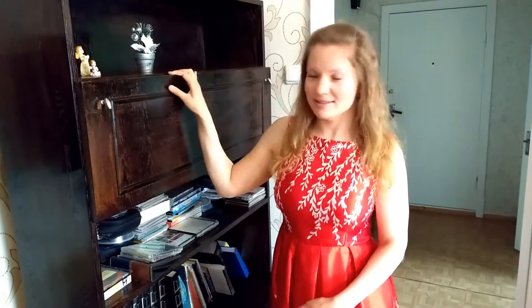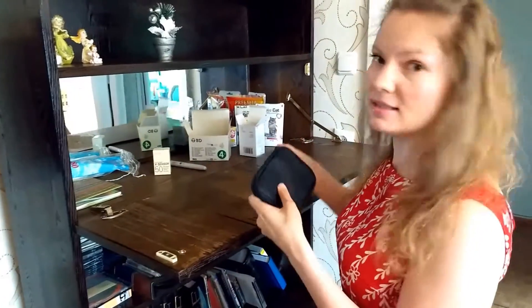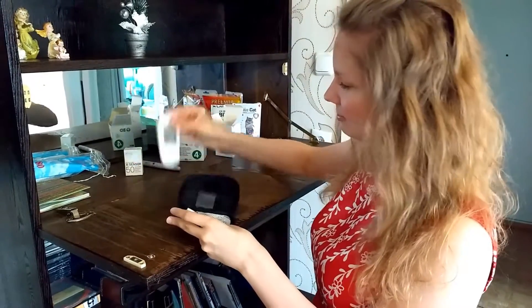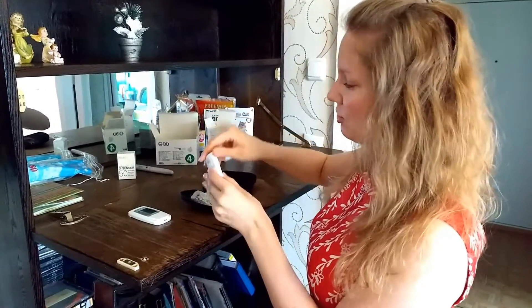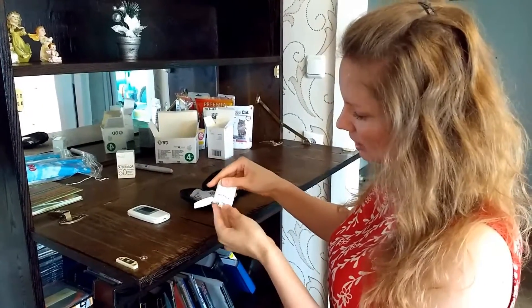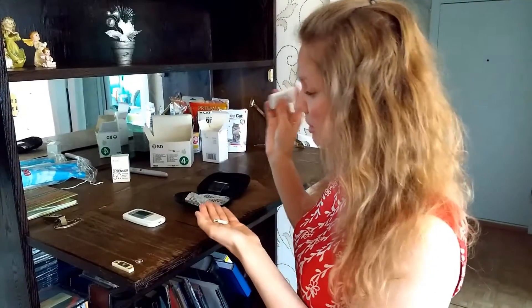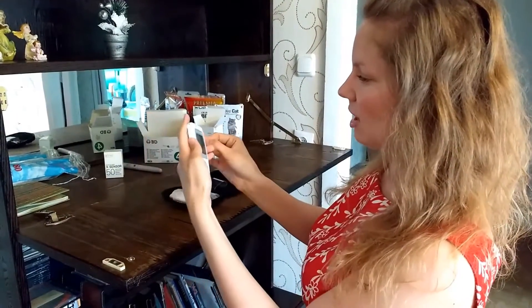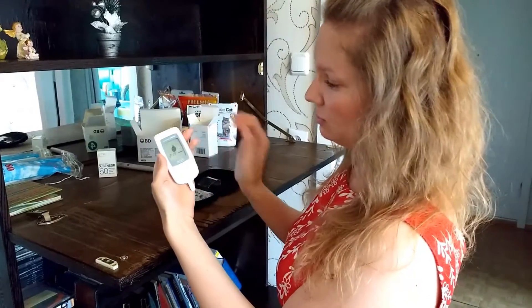It's very good if you have a cupboard like this, where you can put all sorts of stuff you need for testing. First I'm gonna take out this meter — it's the same meter we use for humans. And here are the stripes. Take one stripe out and make sure to close it immediately. Then you're gonna put it in like this, colorful side up, and you don't have to turn it on — it turns on itself.